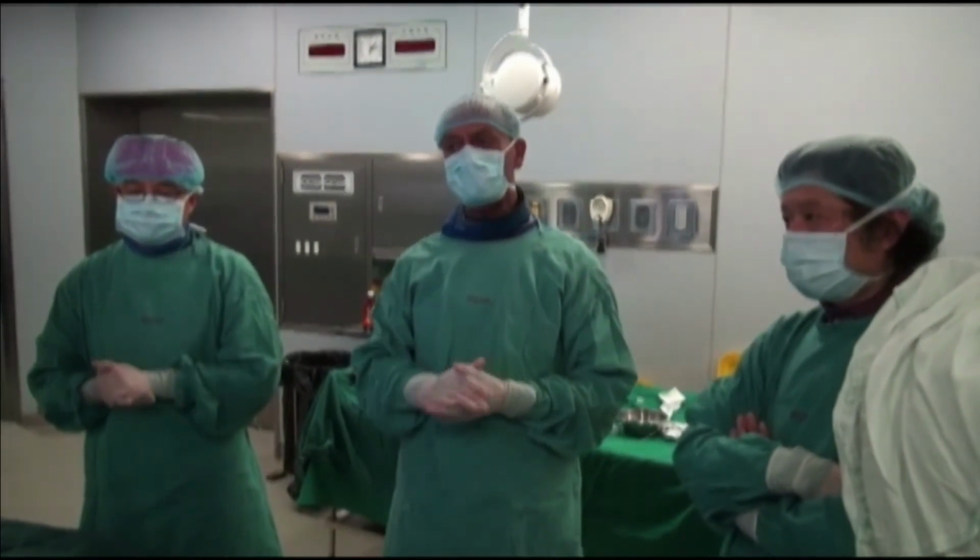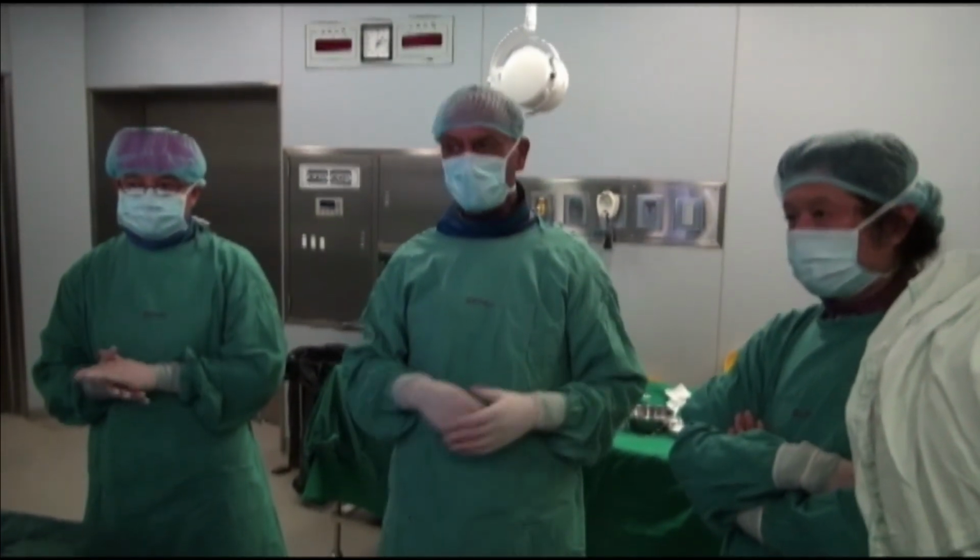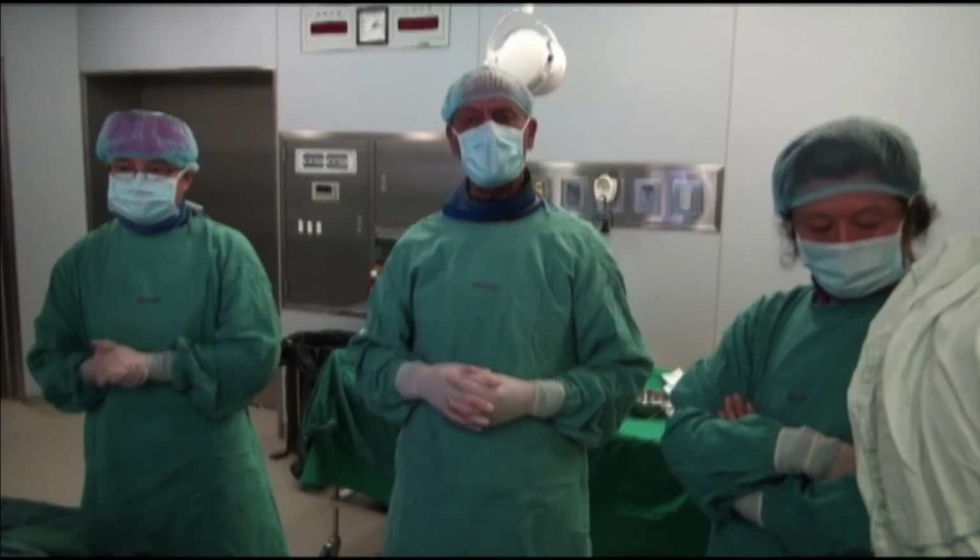So I think overall this is an excellent result for this young boy with the Venus P valve.